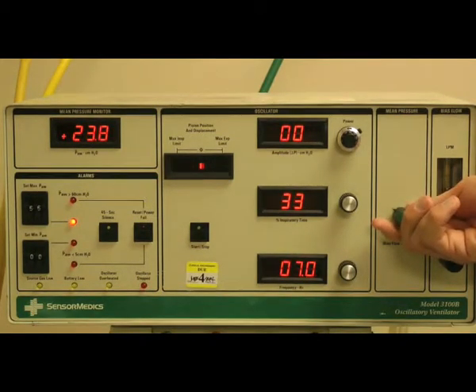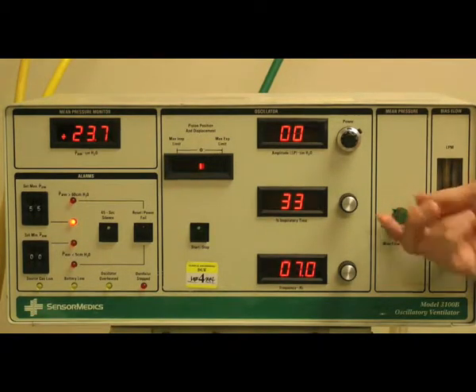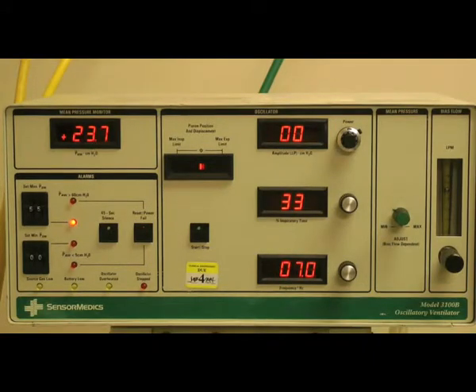If your oxygenation is greater than your goal range, you can decrease your FiO2 by 5% every 5 minutes until your SpO2 is between 88 and 95%. Once your recruitment maneuver has been completed and you've returned your patient to your initial settings, you'll need to observe the patient for 4 hours and increase the FiO2 as necessary during this period to address oxygenation of less than your goal range, persisting for greater than 5 minutes.